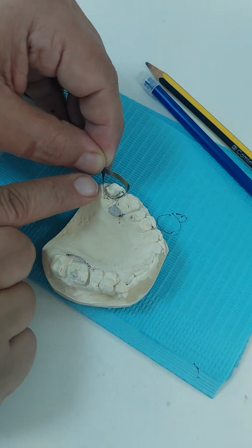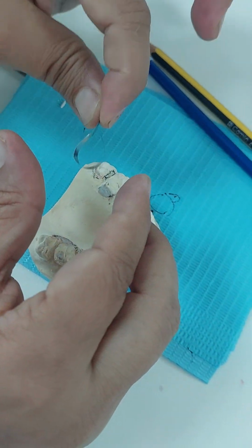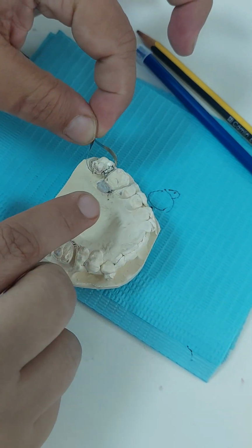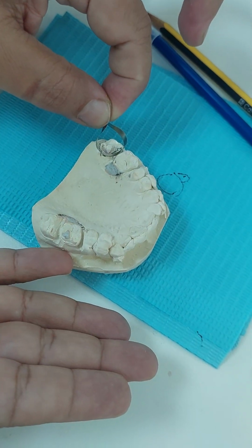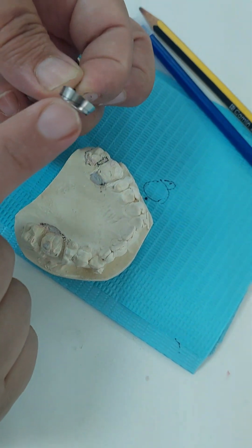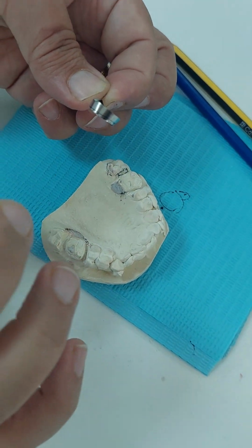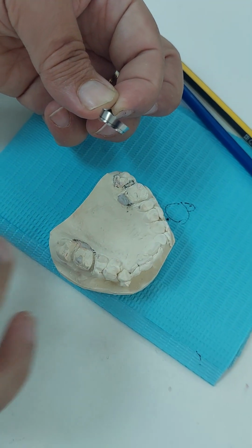Okay, I keep concaving it until it's no longer interfered by the gingiva. I could concave it from here if I'm going distally, but still I have a handle to put in the Tofflemire. Okay, now how is the emergence profile going? Outwards. It's not covering the full occlusal depth. I could even make it even thinner. The most important 2 to 3 millimeters are the ones in the deep gingival margin.